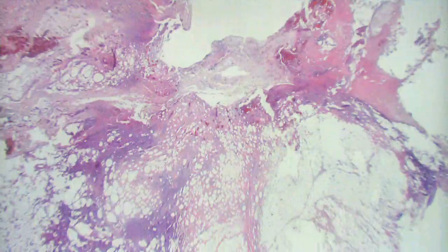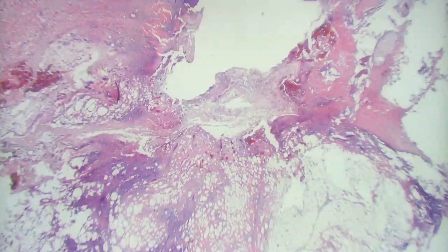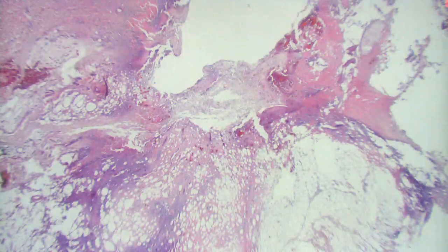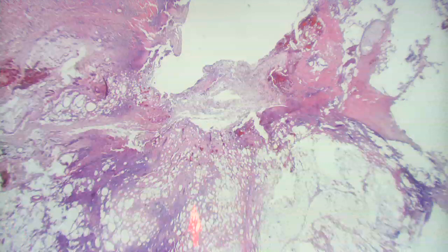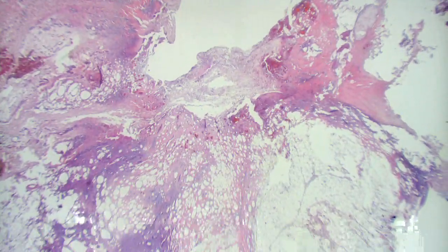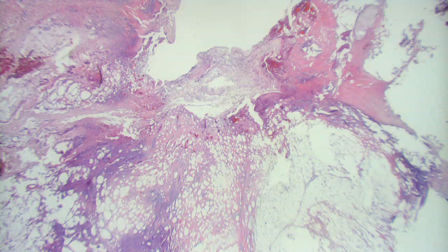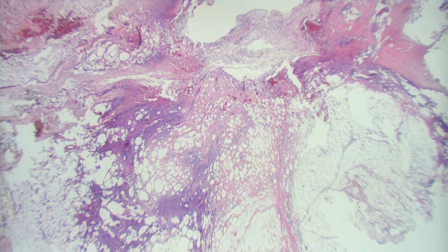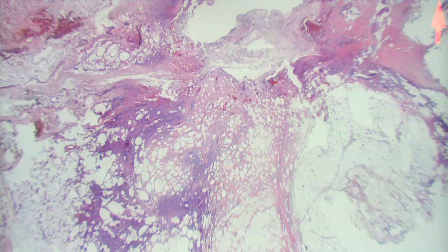Okay, a little different animal here. This is an interesting punch. I don't know if it's an excision or debridement or something like that, so this surgeon might have done this. Okay, so what's striking about this biopsy is that there's this inflammatory infiltrate that's within the sub-Q. So we're kind of going in the panniculitis differential for this.